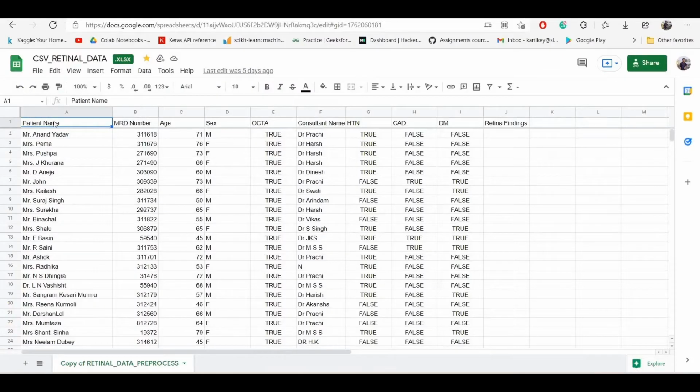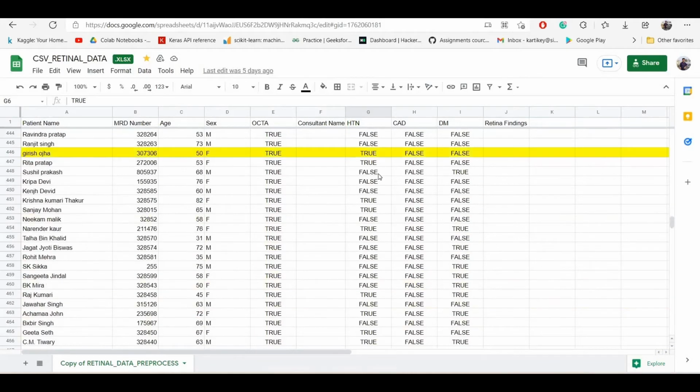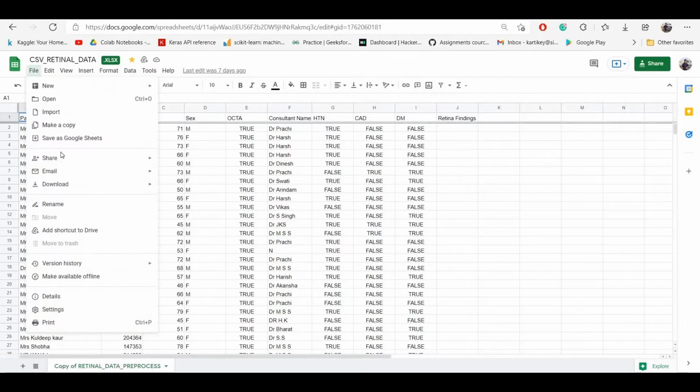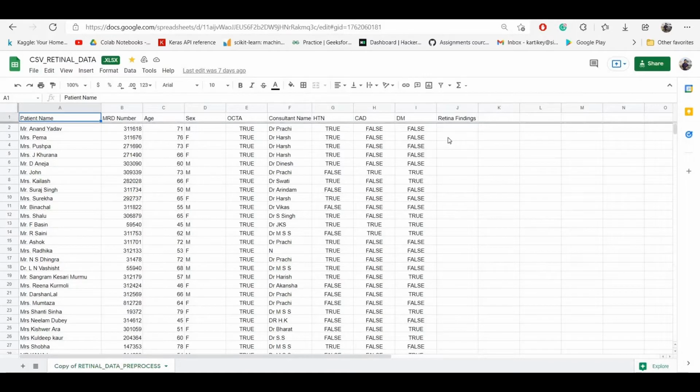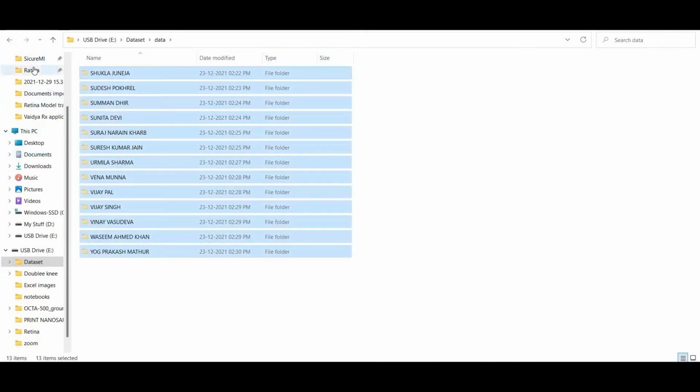Now in this step, we are going to manually enter the patient data from the collected image to the CSV_retinal_data Google Sheet, which contains information like patient name, MRD number, their sex, and age of the patient, and whether they have hypertension, cardiovascular disease or diabetes. After entering the data, we will download this Excel sheet as a CSV file and place this file in the Retina project directory. Now we are going to copy the data from the USB pen drive to the dataset folder in Retina project directory.